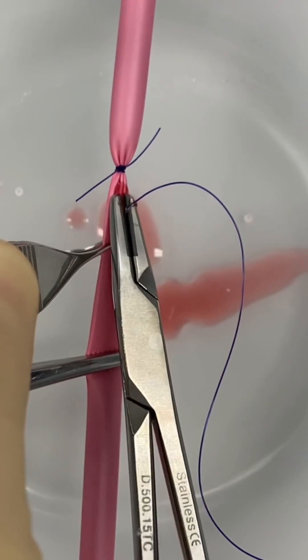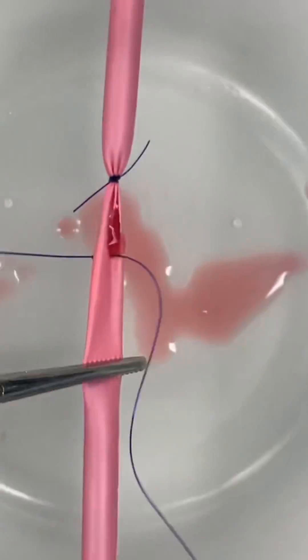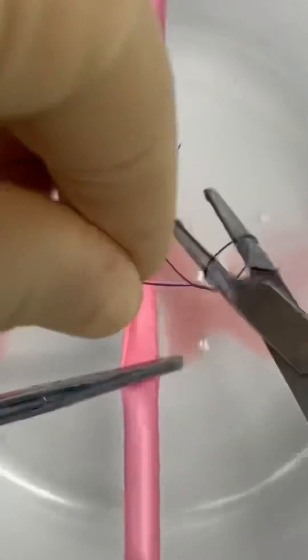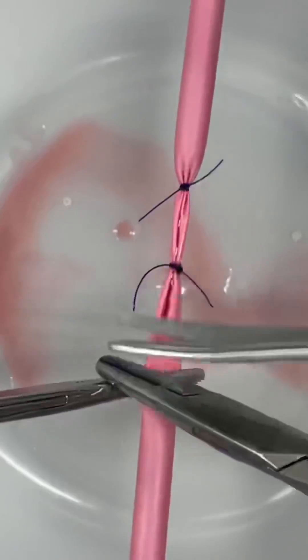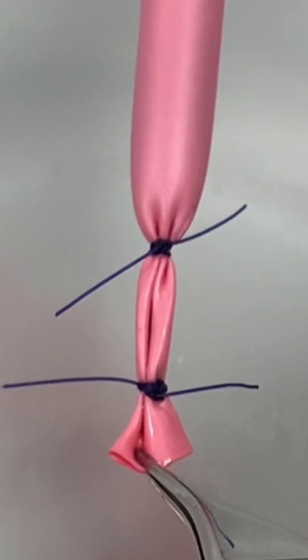If some type of encircling ligature like the constrictor knot is not tied beforehand, it can result in excessive bleeding. Once these two ligatures are in place, the vessel can be cut, being careful to ensure there is no bleeding.